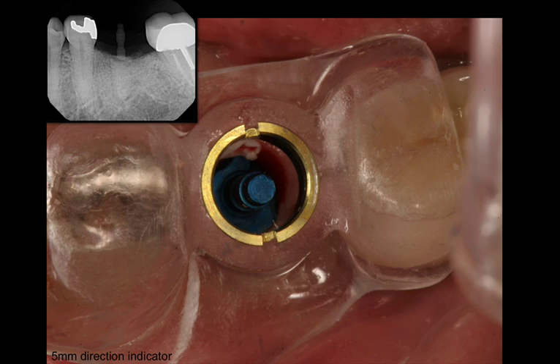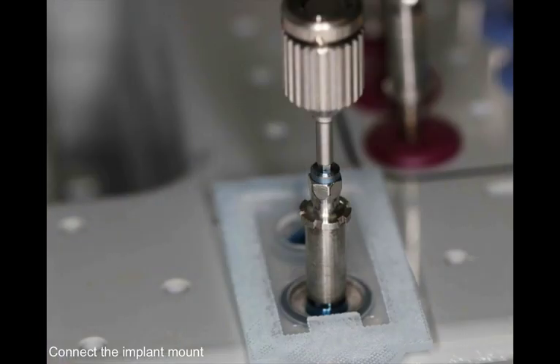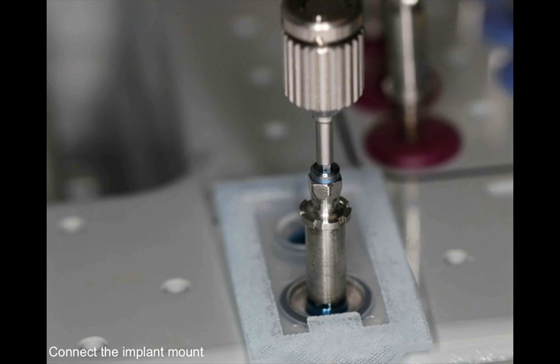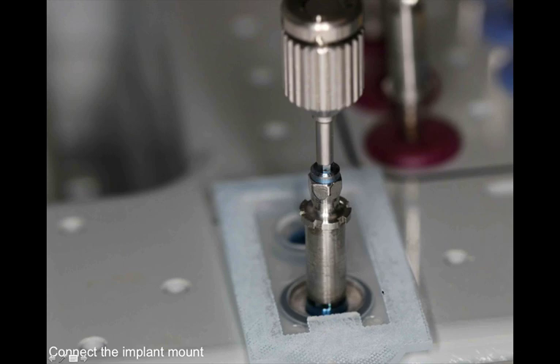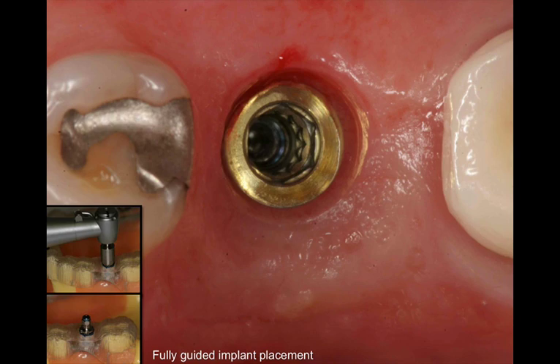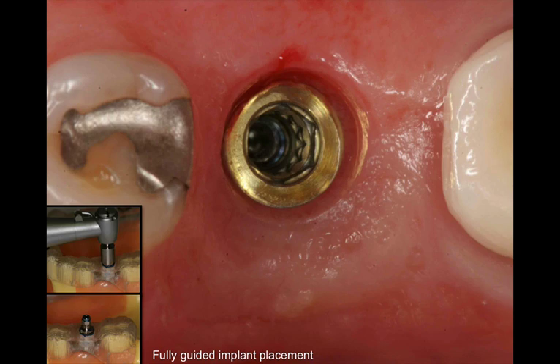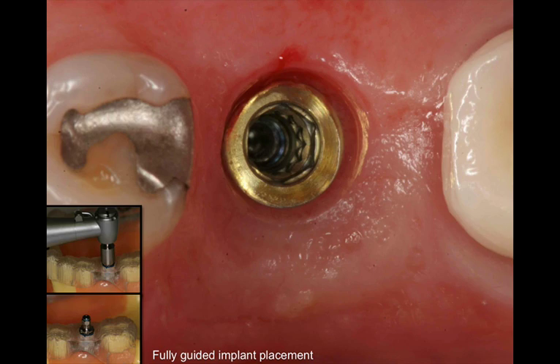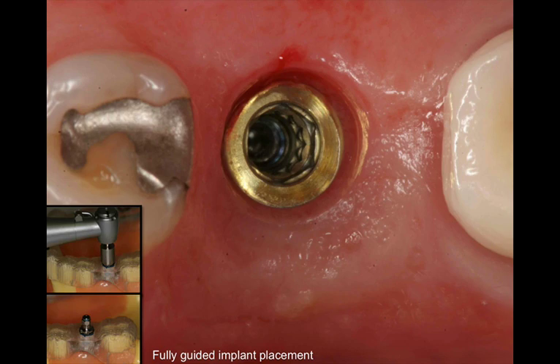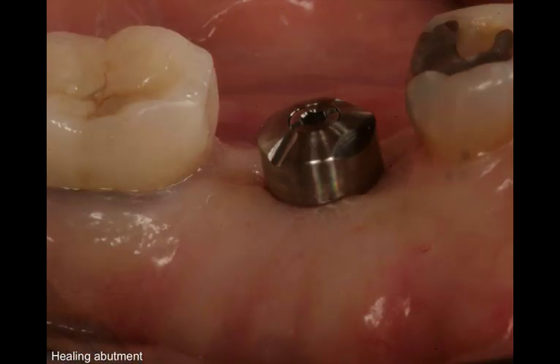Once the osteotomy is completed, the time comes to place the implant. With computer guided implant placement you need to use an implant mount that's part of the surgical kit. This mount is connected to the implant, and you use an implant carrier to carry the implant through the mount and place it straight through the guide. This is called fully guided implant placement — meaning the osteotomy and the implant placement are both performed through the guide. This is especially important in soft bone, where the prepared osteotomy can occasionally redirect during implant insertion; using the guide verifies you're following the osteotomy and placing correctly.